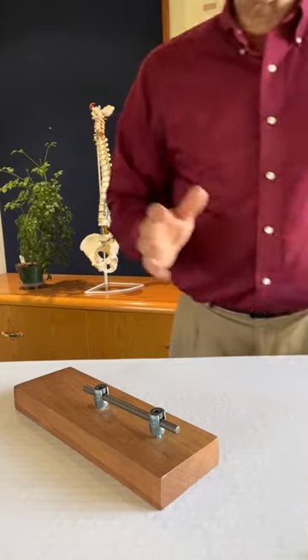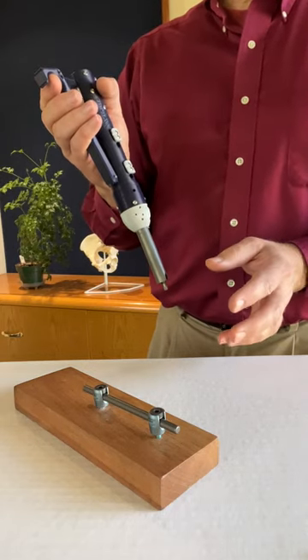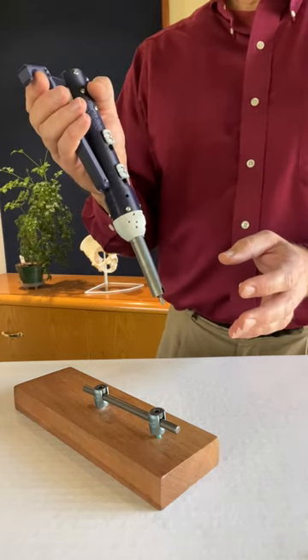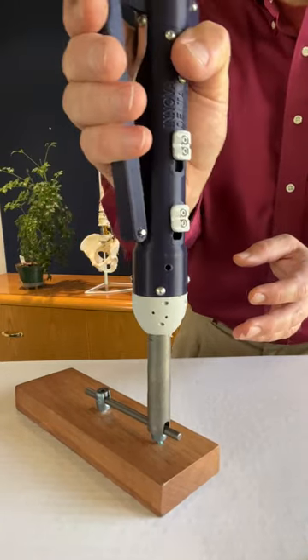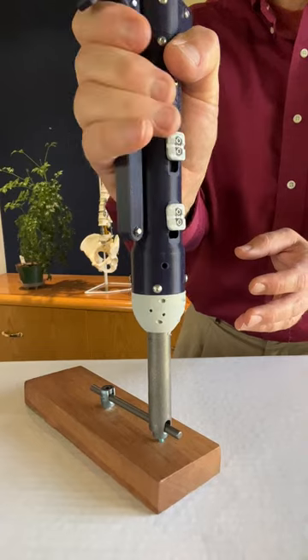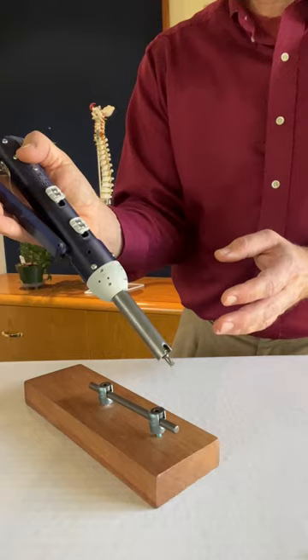But now, only one hand is required with one instrument, leaving the surgeon with one free hand during this final tightening sequence. The counter torque screwdriver is simply placed onto the set screw and the handle is squeezed until the integrated torque limiter indicates that the final torque has been reached.